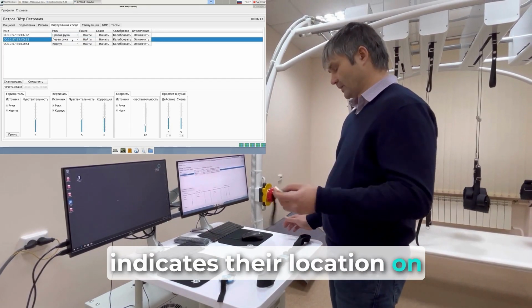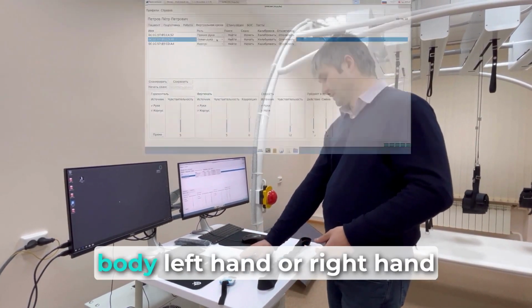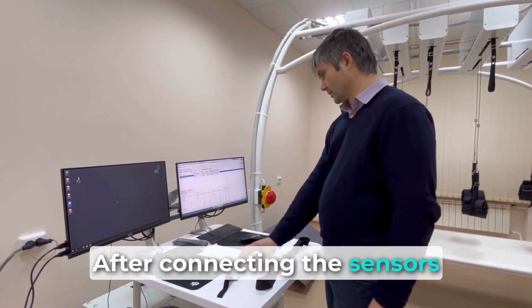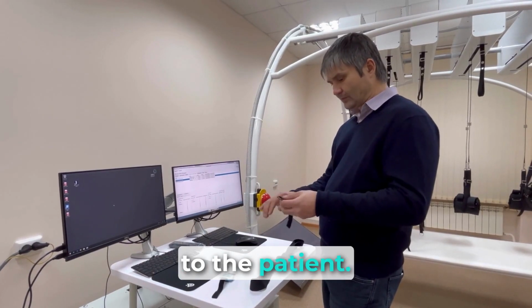Indicates their location on the patient from the list: body, left hand, or right hand. After connecting the sensors and determining the role, the sensors need to be attached to the patient.